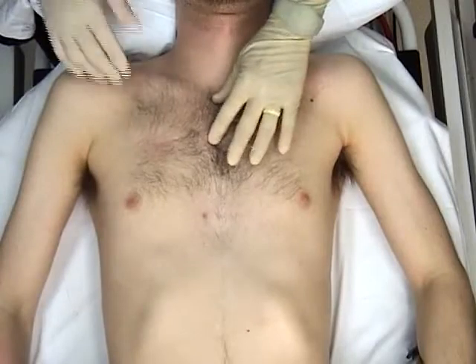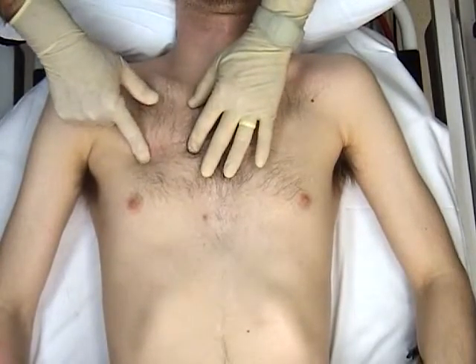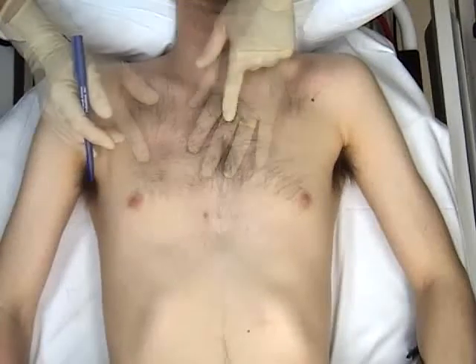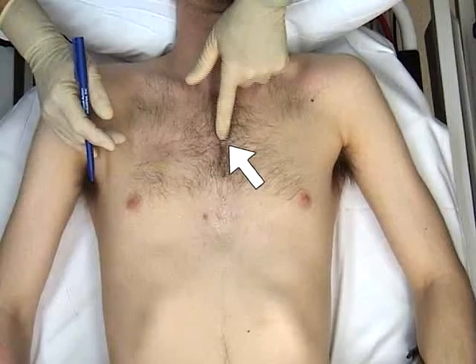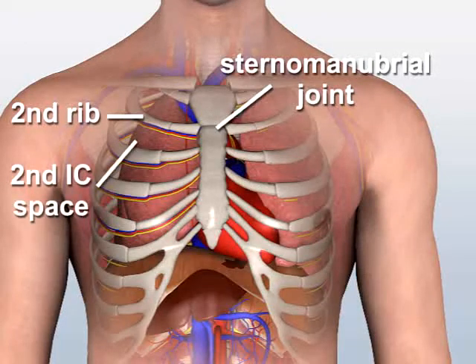Begin by palpating the anatomical landmarks. Anterior needle thoracostomy occurs in the second intercostal space in the midclavicular line. To identify the second intercostal space, first palpate the sternal manubrial joint in the anatomic midline. The second rib articulates with this joint. The second intercostal space lies below the second rib. Needle insertion occurs over the superior surface of the third rib.